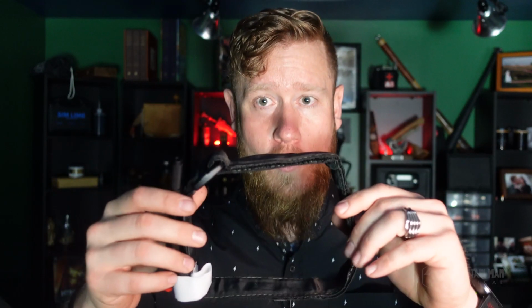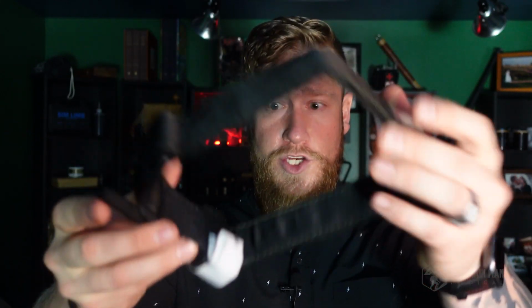And so we're going to open this up. The loop is kind of small. I would adjust this for you. You want this loop to be at least big enough that you can get it around your legs. So if you've got big legs like I do, you're not going to fit in that. So make sure that you're adjusting this tourniquet to a size that'll be a little bit better for you. Make it a little easier for you to get on and off. You want to make sure you can get it over your biggest limbs, of course, which is why you want to make this for about the size of your legs. So you can just loop this around, tighten it down, and you're good to go.